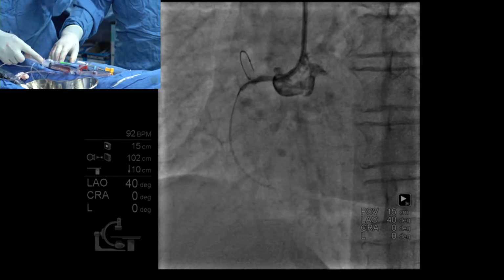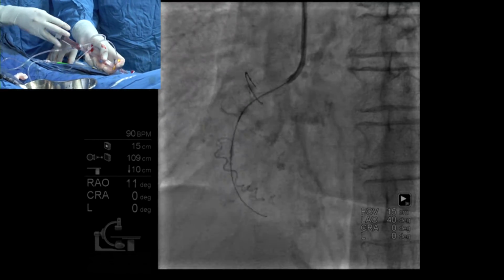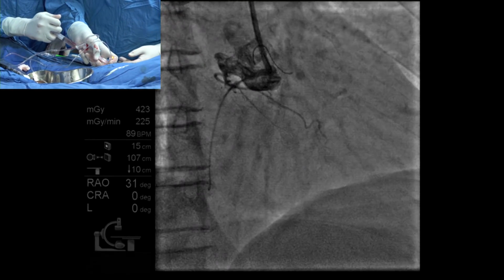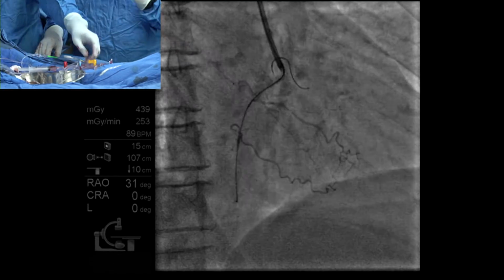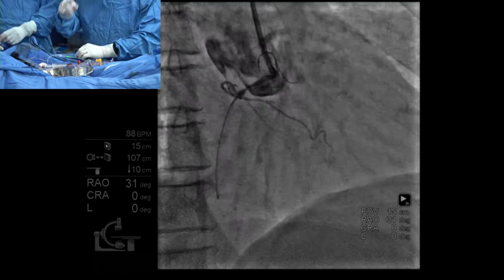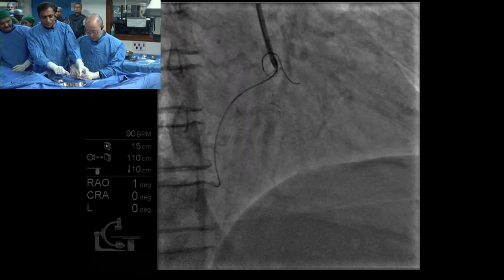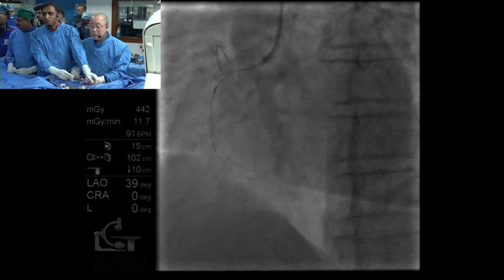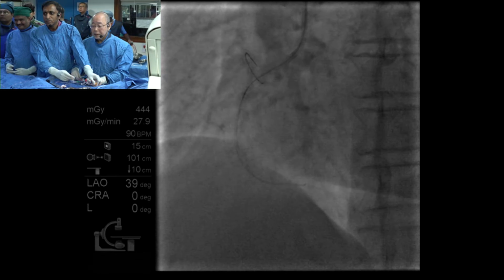It's good. RAO. Yes, maybe good. It's good. Okay, LAO. Dr. Saito, does the wire feel free? Yeah, feels free.